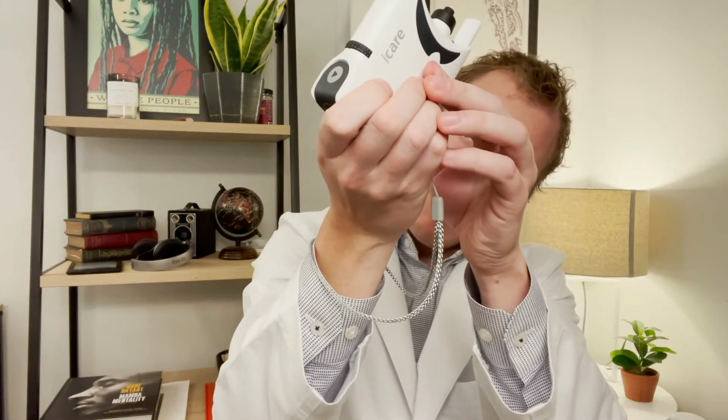I'm going to go all the way down towards that 8.5, which is what I measure myself. And then you can actually take individual measurements by clicking this, but I like to hold it down, and it'll take as many measurements as is necessary for it to determine that it's a quality measurement. So I just like to hold it down.